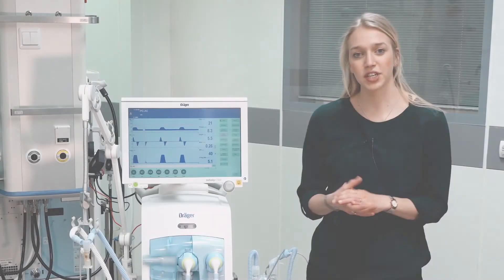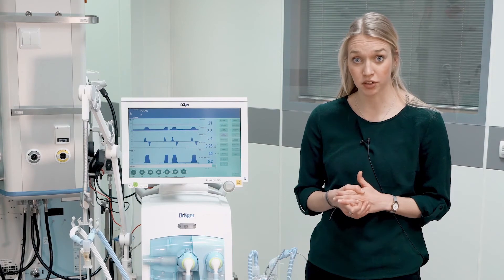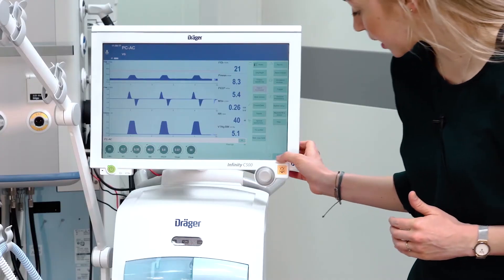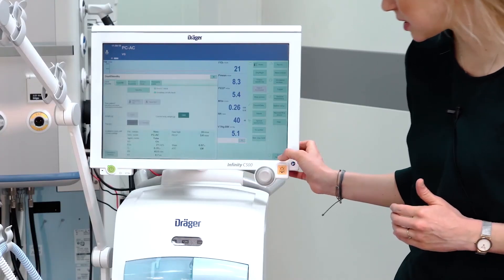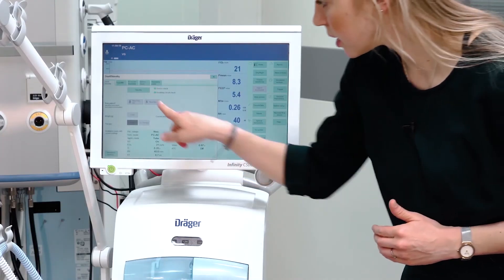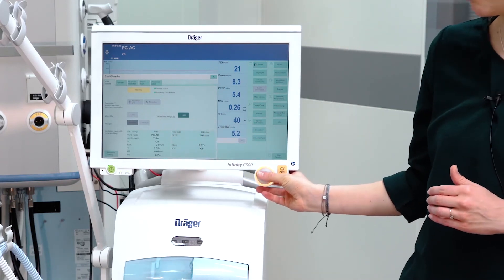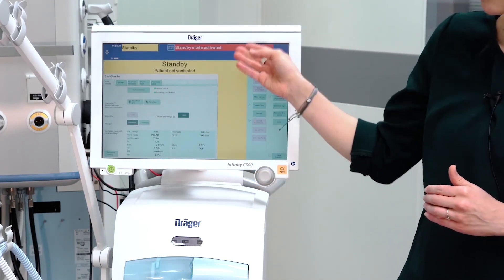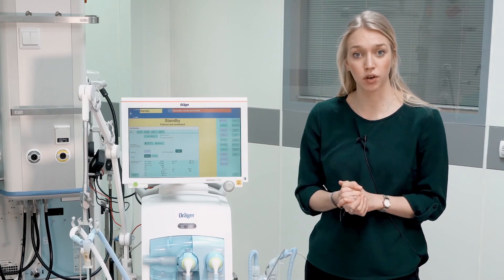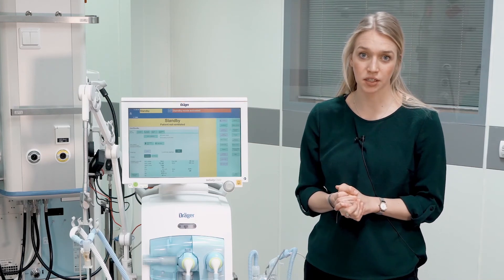If you want to change to a different therapy type like non-invasive ventilation or O2 therapy, or you want to end ventilation therapy in general, please select via start standby the standby button and confirm with the rotary knob. A red alarm will indicate to you that the patient is no longer ventilated.